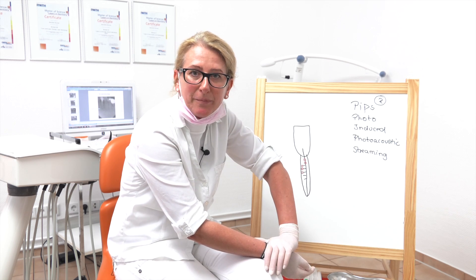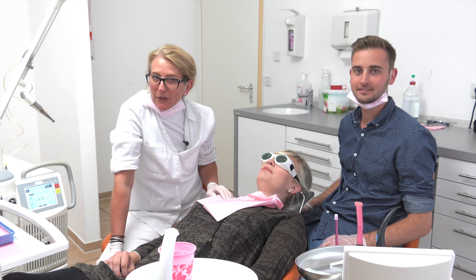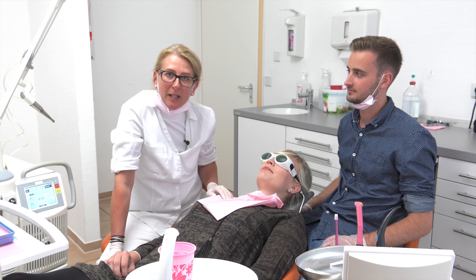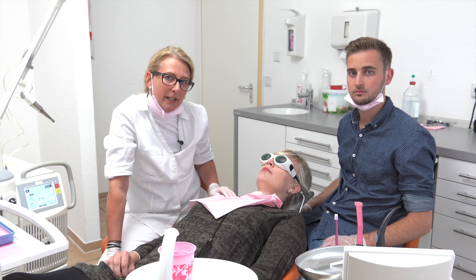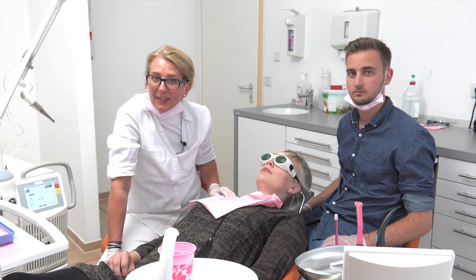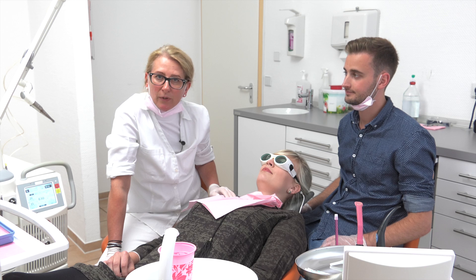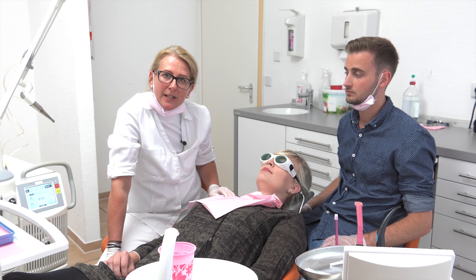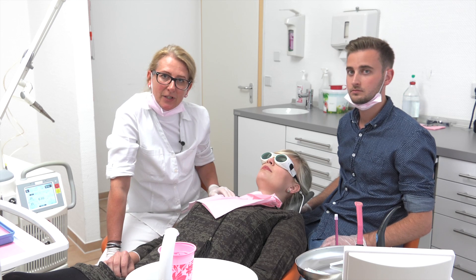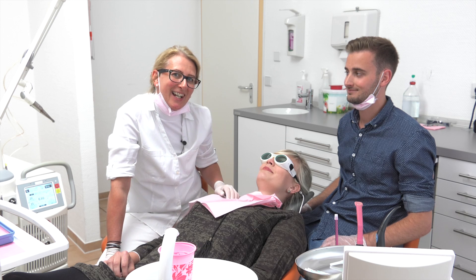Now I show you a picture — can we see the picture? The picture shows the inside of the tooth; you can see the sick tissue and the inflammation. For today's treatment I need medical assistance, and Jaco was kind enough to come around to help me. Jaco will do the rinsing and I am responsible for the laser.